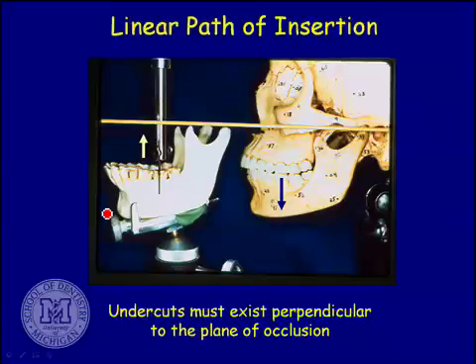I mean, if you're eating a jujube or a gummy bear, by the time your front teeth are 5 millimeters apart, the partial's already completely unseated. So it's just during the first couple millimeters of opening that you want that resistance to displacement. And during just the first millimeter or 2 of opening, if there are some sticky foods in here, the direction of the vector is pretty nearly perpendicular.